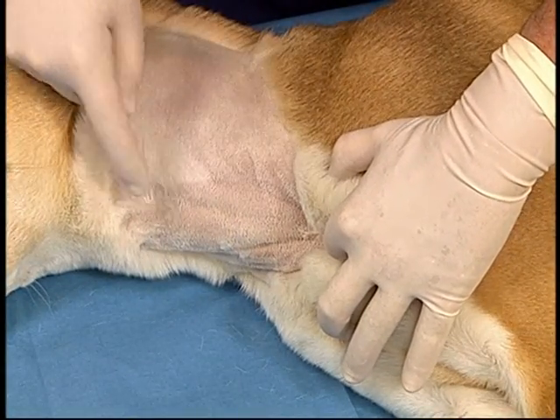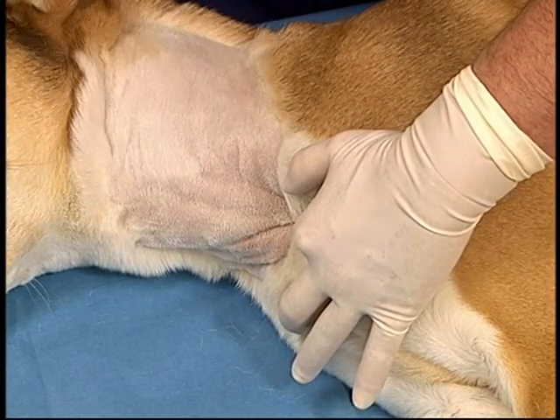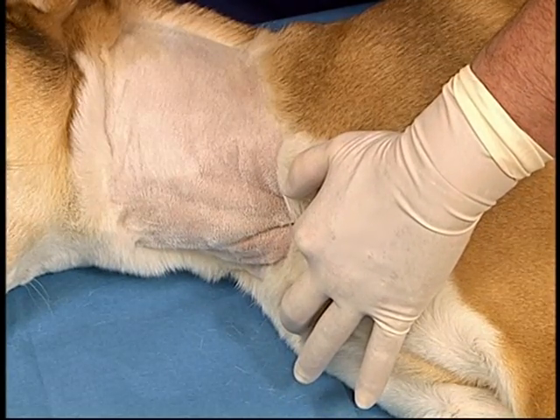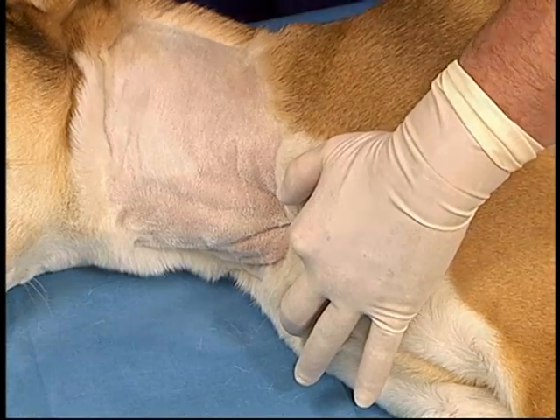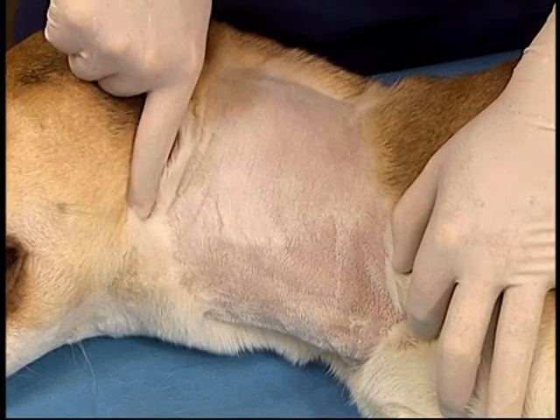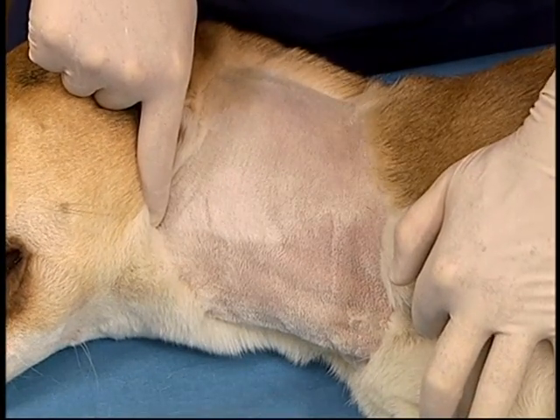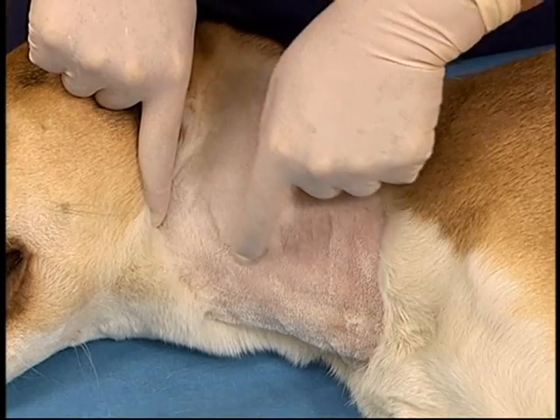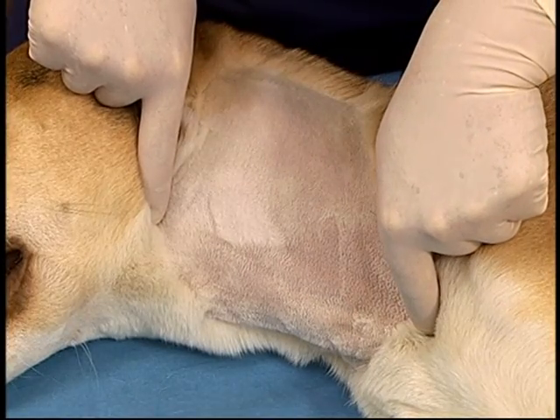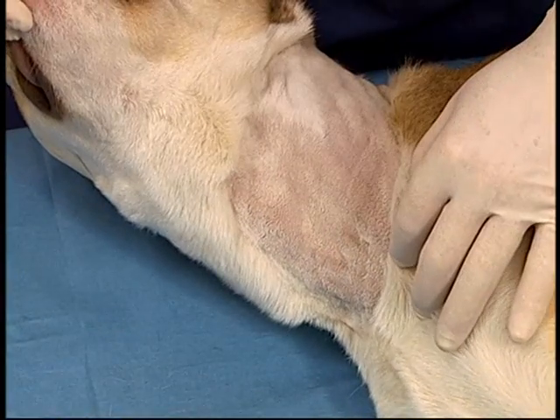When holding off the jugular vein, care should be taken to ensure that the index finger depresses directly into the thoracic inlet rather than retracting the skin caudally at the same time, which will flatten the vessel. The jugular vein runs from the angle of the mandible to the thoracic inlet in a straight line, and this location is maintained no matter what position the animal's head is in.